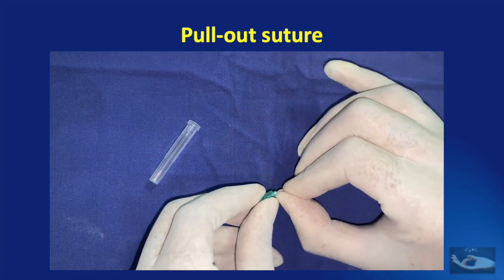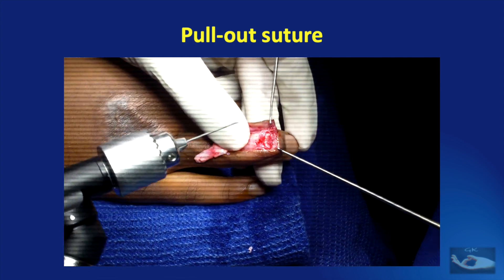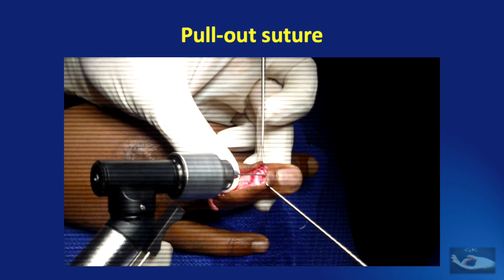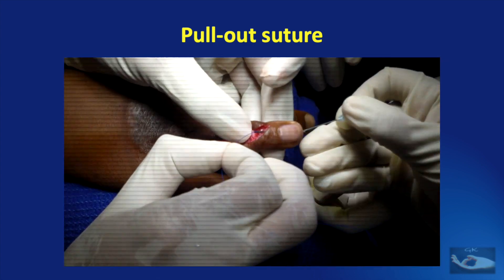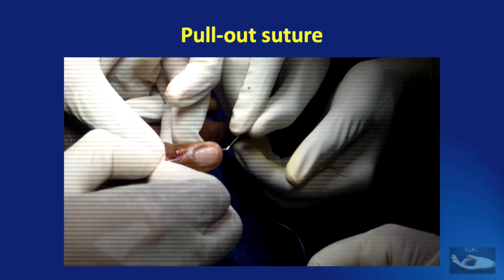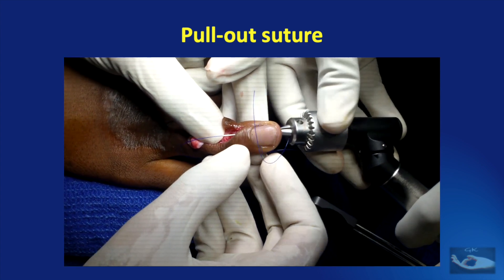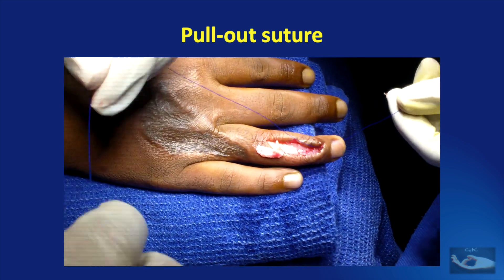Now we take an 18 gauge needle, break the hub away, and use the needle alone. This needle has to be passed with the drill, entering through the radial side of the raw area we have created on the dorsal aspect of the terminal phalanx and exiting on the tip of the finger. The needle passes longitudinally but slightly oblique from the dorsum to the tuft of the terminal phalanx. The drill is disconnected and a 3-0 polypropylene suture is taken. The free end of this suture is passed through the proximal end of the needle to exit from the tip of the finger. The end of the suture is grasped and pulled for some distance, then the needle is taken out from the distal end using the drill. The 3-0 polypropylene suture material is now passing through the longitudinal drill hole, with the needle end proximal and the free end distal.